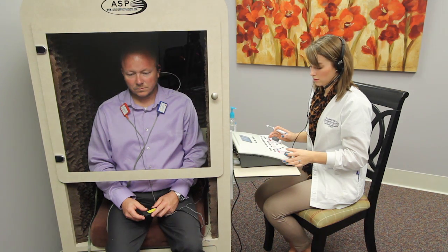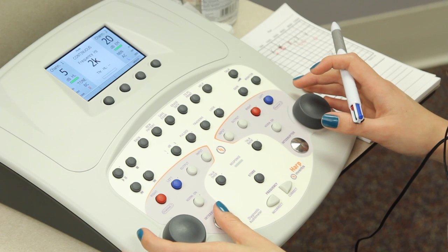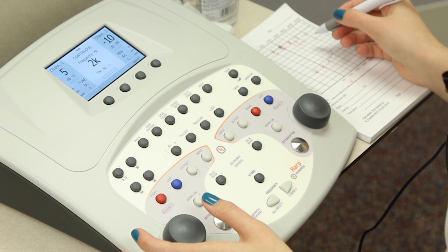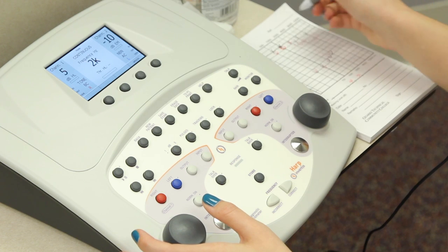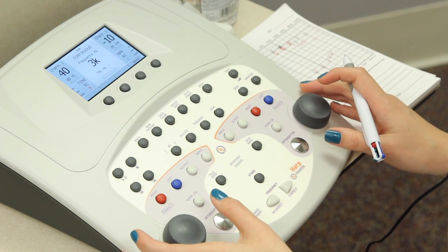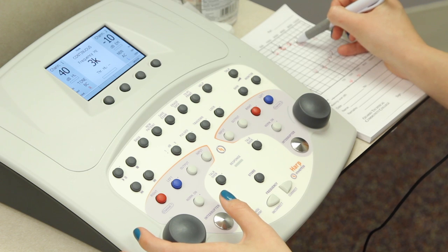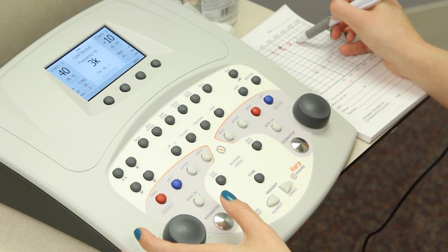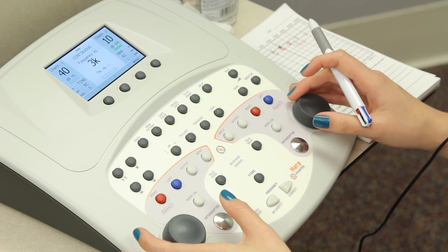So we found his threshold, and now we're going to plateau our masking. At 3,000, his left ear threshold is at 10 decibels, so we're just going to add 10 and start his masking at 20 decibels.